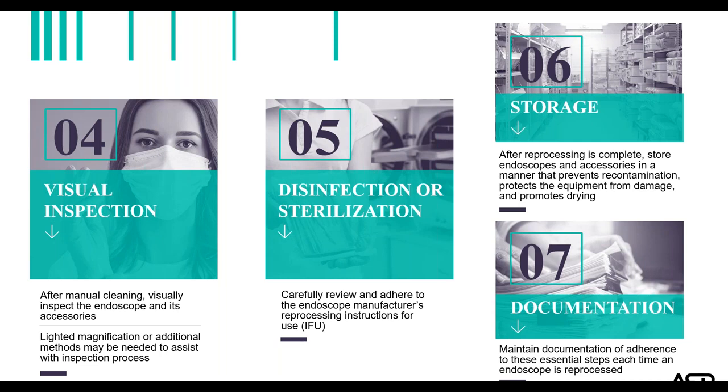And what they've listed are date and time, ID of the endoscope and accessories, method of verification of cleaning and results of cleaning verification test, number or identifier of the reprocessor or sterilizer, results of efficacy testing, so that would be your test strips, identification of persons doing the reprocessing, who's putting it in, who's taking it out, lot number of the processing solutions, disposition of defective items or equipment, and maintenance of water systems.